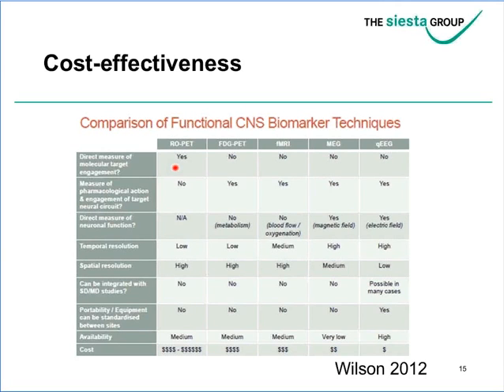If you look at what the other objective measures to measure brain activity are, they are mostly the typical other brain imaging methods like PET scans, functional MRI, or magnetoencephalograms, MEGs. Compared to all these, while at the same time being a direct measurement, you are portable, and above all, the costs are the lowest, and the availability is therefore very high. So you really have a competitive instrument here in the form of the EEG that competes in many respects with brain imaging at a much lower cost and at a much higher portability.